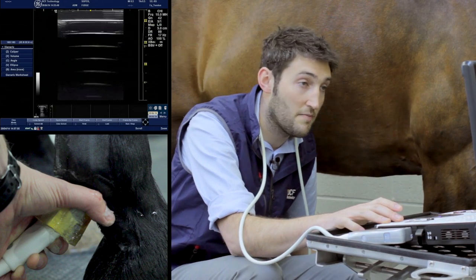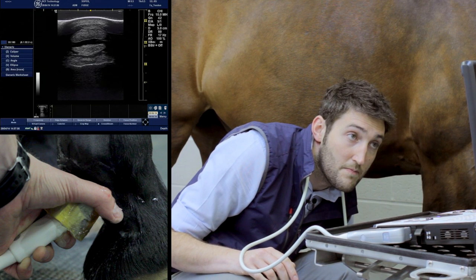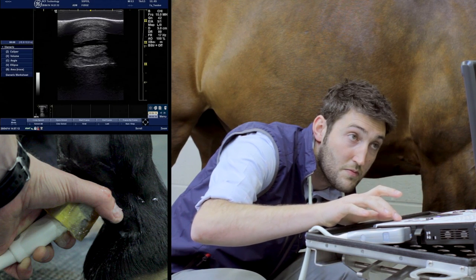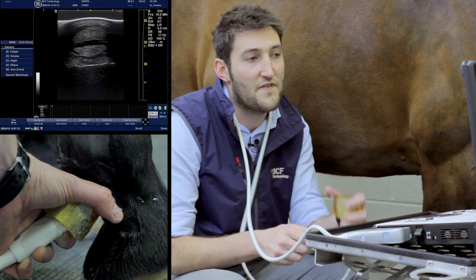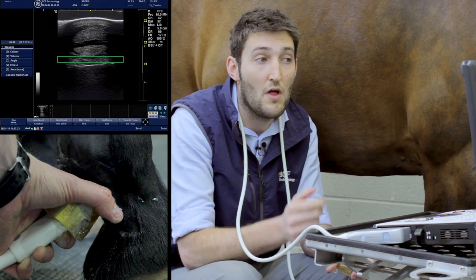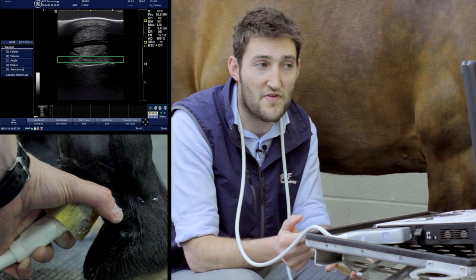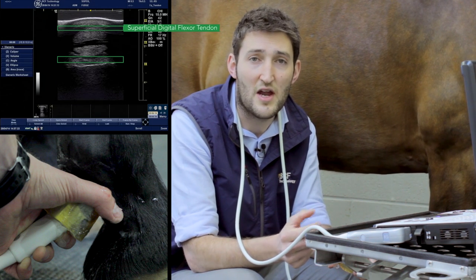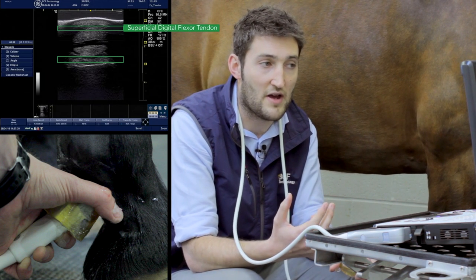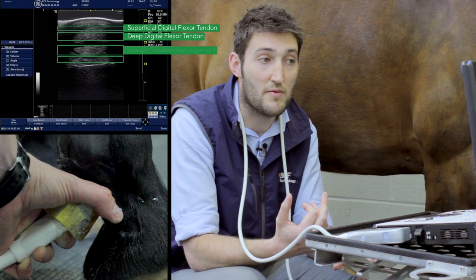Moving down the leg to zone 1B, it's fairly similar, but we can see now that the oblique sesamoidean ligaments have formed together to be a single unit. Also, the superficial digital flexor tendon has become very thin and is almost forming a lobe at the medial and lateral border. The deep digital flexor tendon is still quite ovoid and quite large, and we've also got the straight sesamoidean ligament.